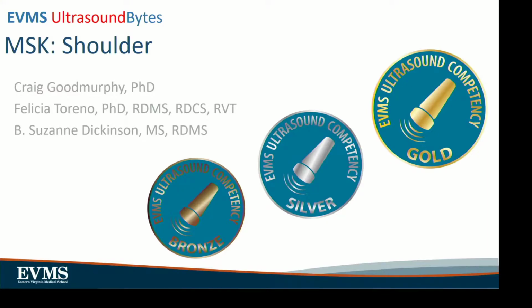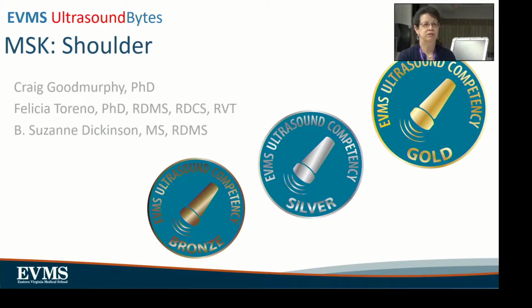Okay. Hi, I'm Suzanne Dickinson with the EVMS Ultrasound Education Department, and today we're going to go over some MSK and we're going to cover the shoulder.